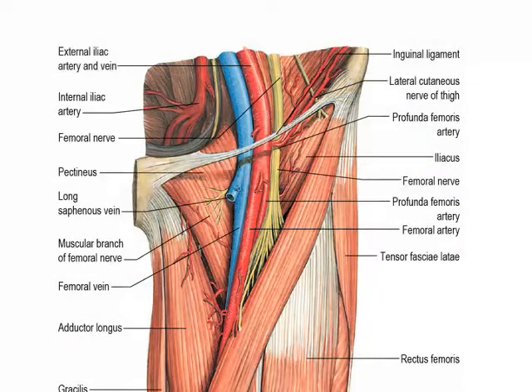The first step in obtaining femoral artery vascular access is to define general landmarks such as the location of the iliac spine, pubic tubercle, and femoral artery pulse through palpation. The objective is to puncture the artery on the anterior surface, below the level of the inguinal ligament, which runs between the iliac spine and pubic tubercle.